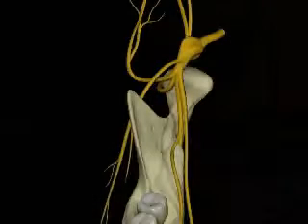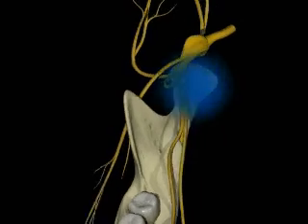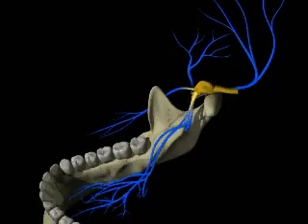The objective of the Gow-Gates technique is to deposit local anesthetic immediately anterior to the neck of the condyle. This is in close proximity to the mandibular branch of the trigeminal nerve after its exit from foramen ovale. With the Gow-Gates technique, we should be able to anesthetize all of the sensory branches of this nerve, including any accessory nerves.